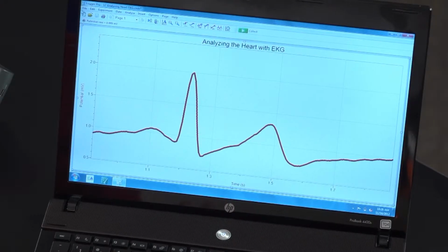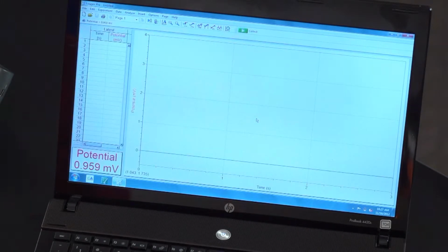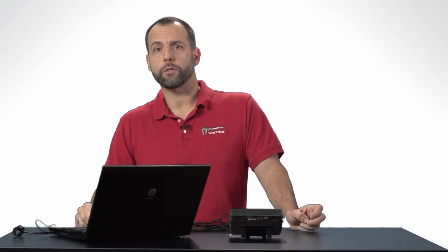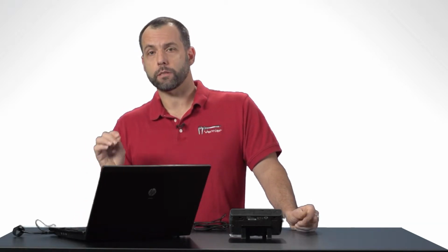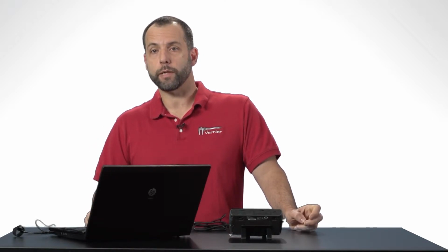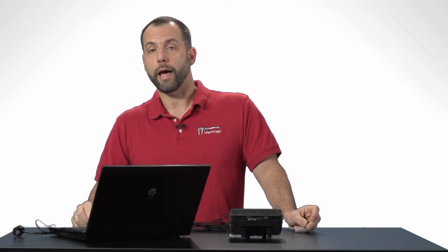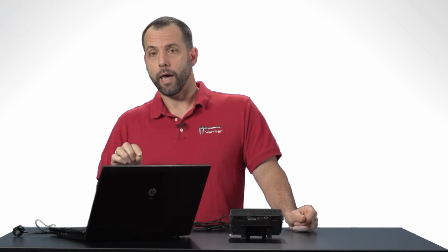What I'm going to do is just start completely over. So I'm going to say File New. And this will take me back to the default EKG screen. Now, one of the things that you can do if you're recording an EKG is you can use something now in Logger Pro called a digital filter. What a digital filter is, is it's a way to clean up a trace, but by using software. So we use a special algorithm in the software to make that EKG trace look clean and actually to keep some of the key characteristics. That's to keep the QRS peak high and to do a few other things.